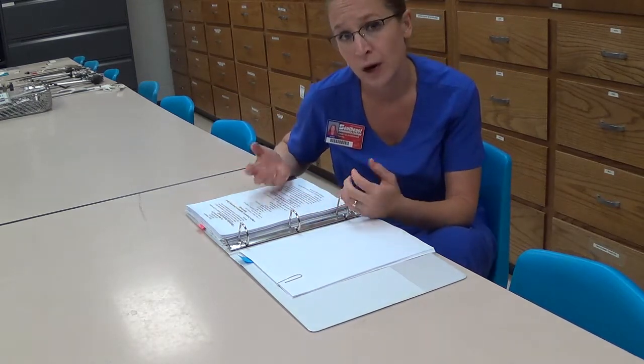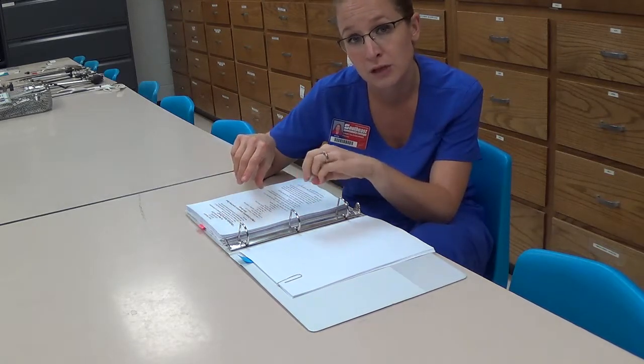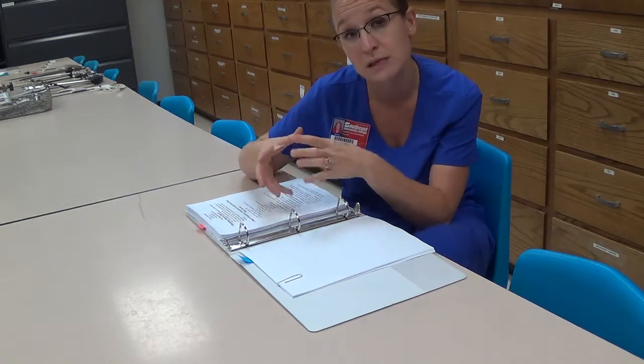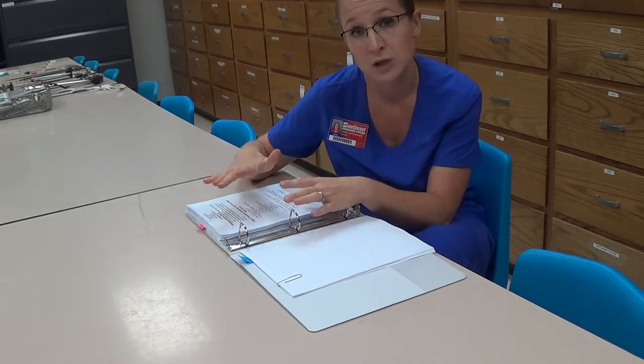I usually have students come in and view a video within the Moodle course under unit three, 'Counting.' It's about an eight-and-a-half minute video that identifies all the pieces of the Bookwalter, talks about how to organize the pan, how to count each of the instruments included, and then shows how to attach it onto the bed.